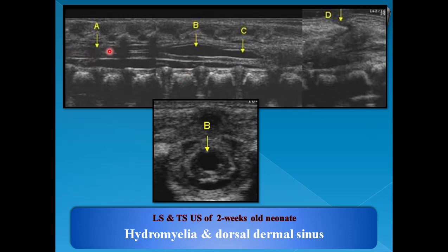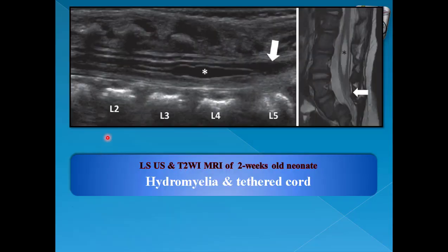Transverse image will show the transition of the normal cord into the cord which surrounds a CSF collection. This is an example showing the normal central spinal canal — very narrow — then becoming widened in a focal form of hydromyelia. There is an associated dermal sinus tract. The TS image shows the spinal cord surrounding a collection of CSF, and the dilated central spinal canal. Another example shows the cord tethered ending at L5 vertebra on sagittal T2 MRI.